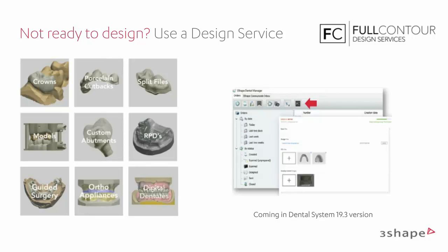There's one more question here. Where can I find a video for snap-on denture design? I'm not sure if we have a particular video for this, but I can write back to you, Vijay, and I'll ask one of the guys to discuss this snap-on denture design. Also, Tanya has one more question: will Trio Smile Design allow lower teeth shaping? We are working on that also. I know that's very high on the list. I don't know the exact release date for that.